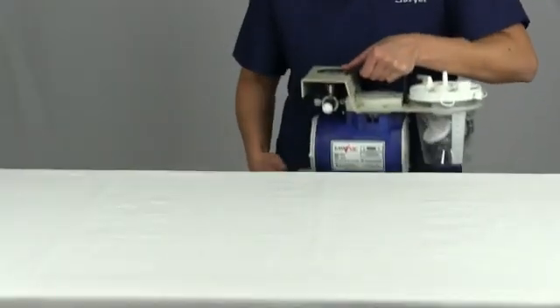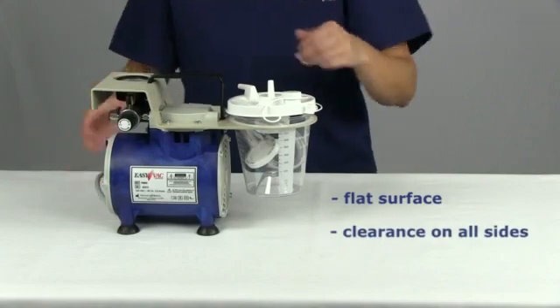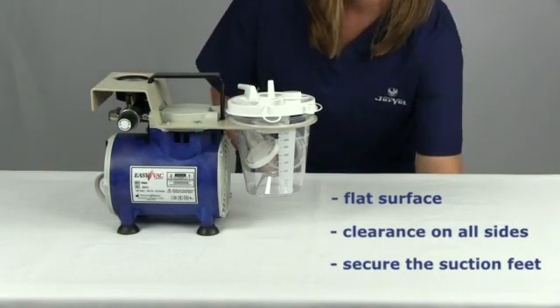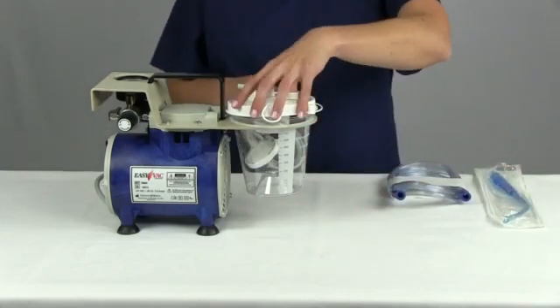When you set up this unit, for safety purposes, please be sure to place it on a flat surface, have clearance on all sides, and secure the suction feet by pressing down on the unit. This will ensure that your unit will remain in place during the procedure.